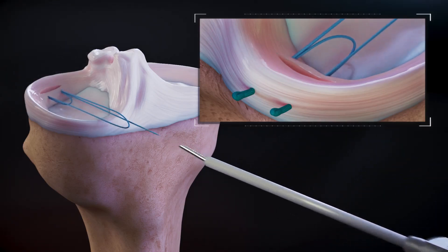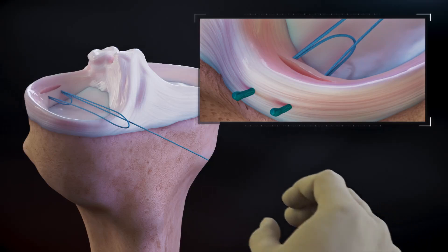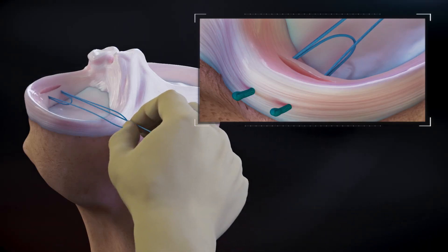Upon removing the device from the joint, a suture loop and a loose end of suture will be outside of the portal. Outside of the joint, pinch all the sutures and gently pull to set the implants.